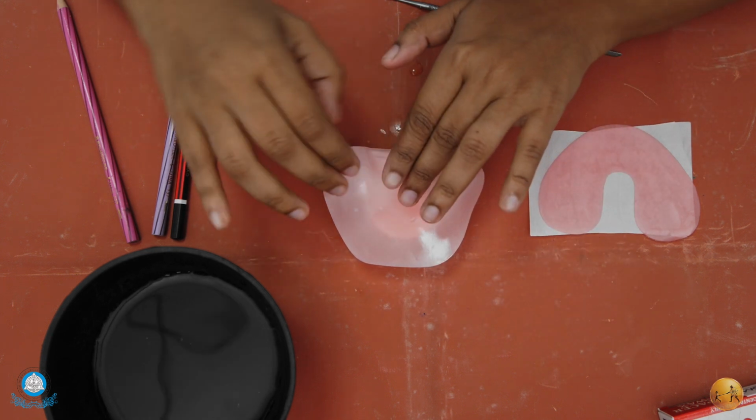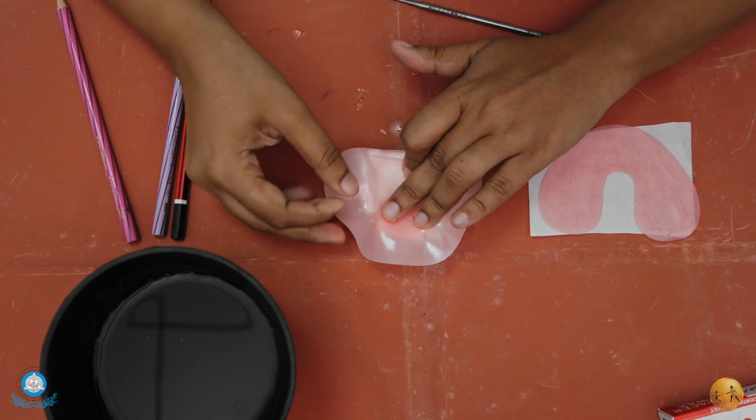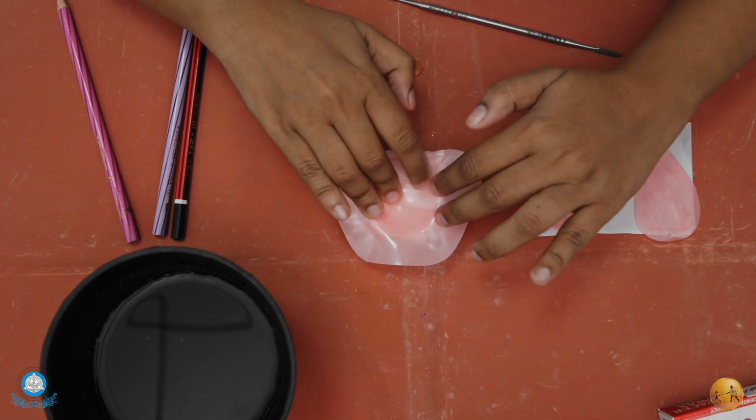I have softened the spacer. From the palatal area, slowly start adapting onto the ridge area with your fingers.